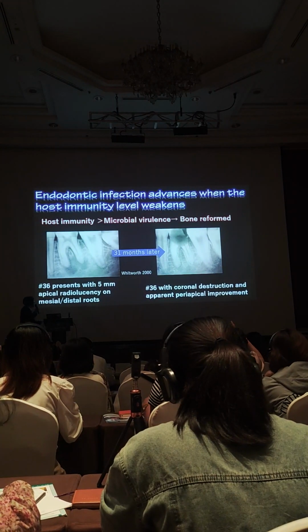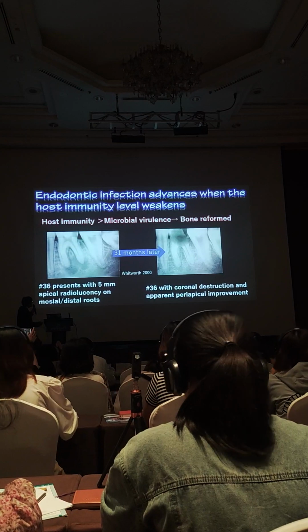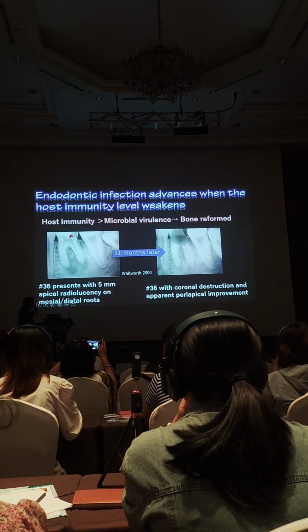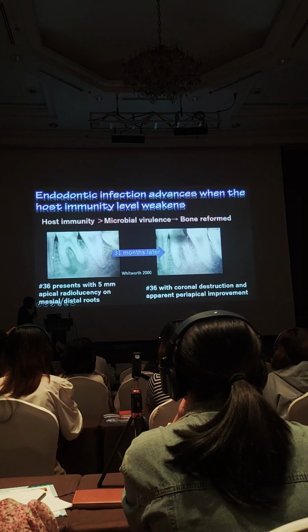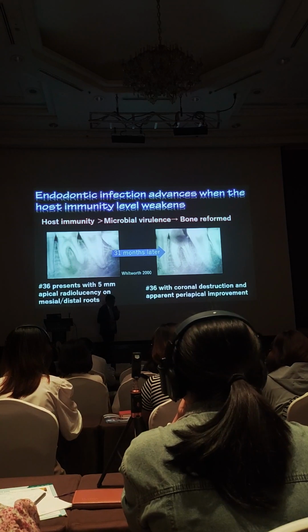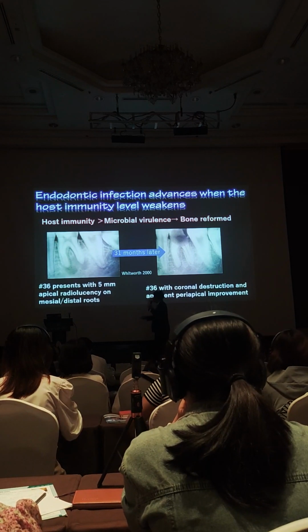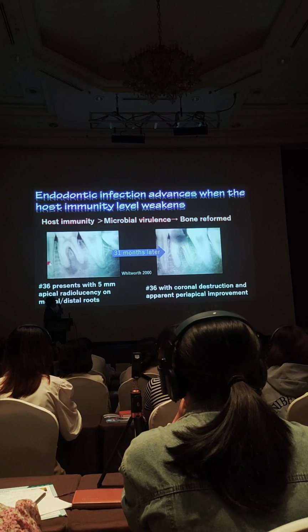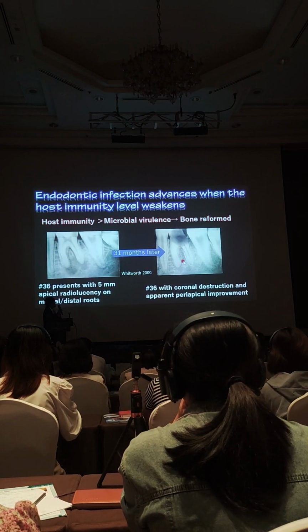So here you see the big lesion. You see the cavity reaching the pulp, creating acute pulpitis. However, the patient refused any treatment because she was poor. So she decided to go home and no treatment. However, she waited 2 years and she came back.